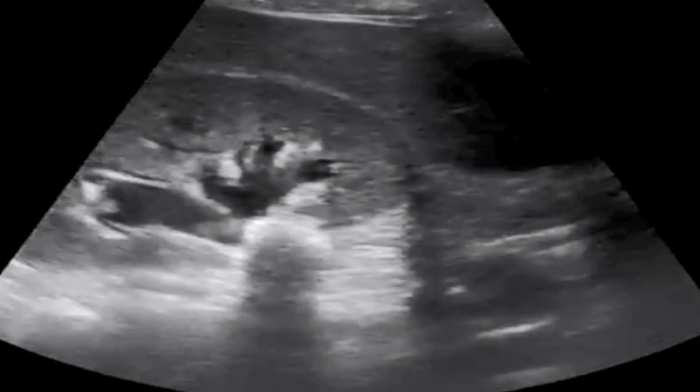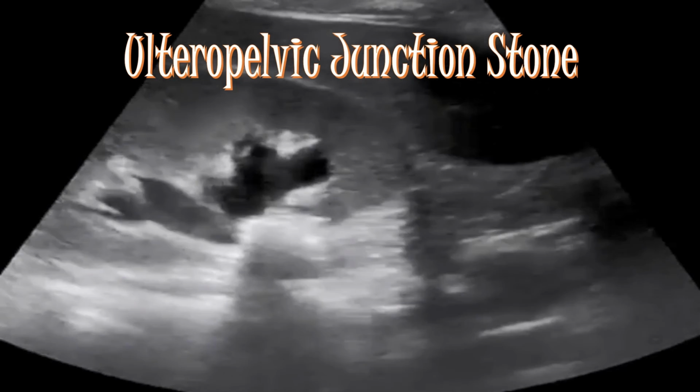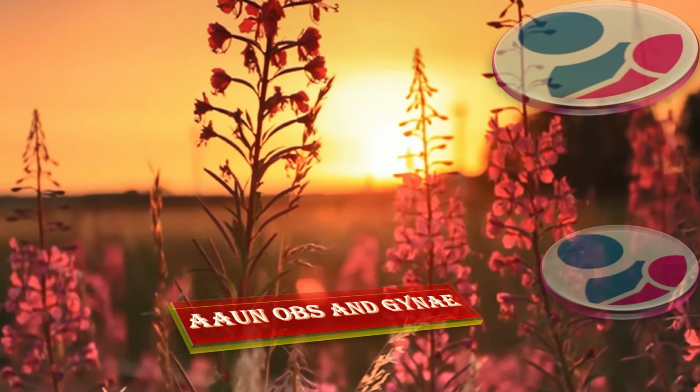Here we have a uretropelvic junction stone demonstrating shadowing plus hydronephrosis. So that was all about ultrasound scan for detecting renal stones.